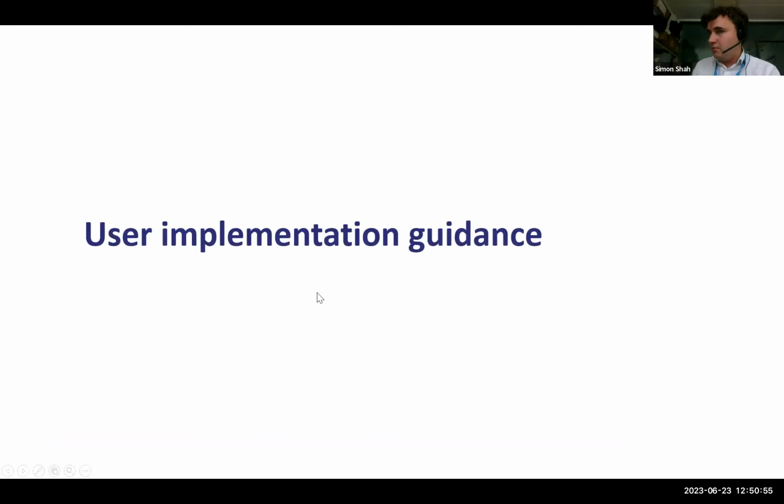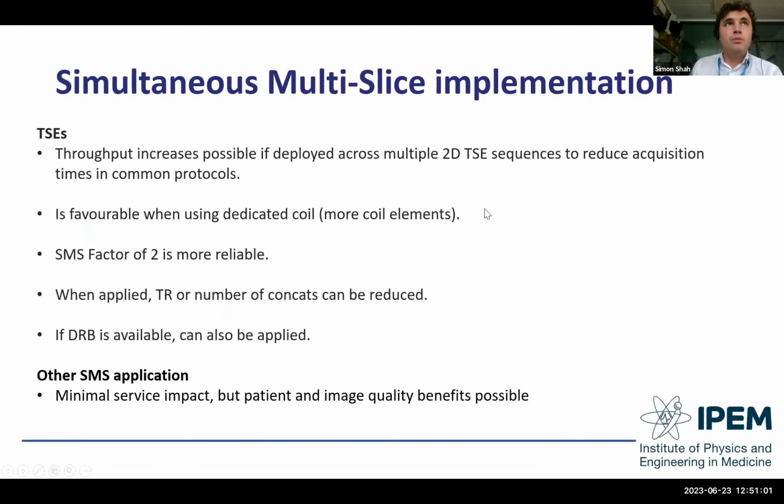So how do we go around implementing some of these techniques when you're at the scanner? So when we're talking about simultaneous multi-slice, I'm only going to talk about TSEs because these are the routine protocols that you're going to be wanting to use to shorten your acquisition time. And there's going to be multiple of these, predominantly in MSK imaging.